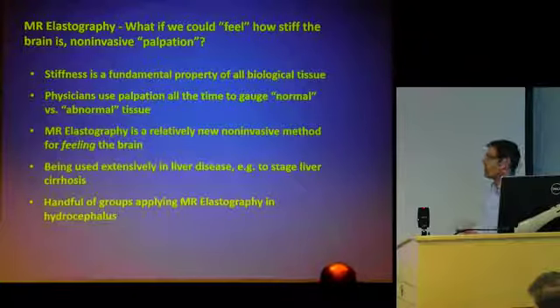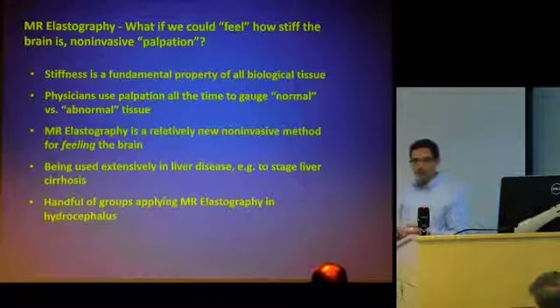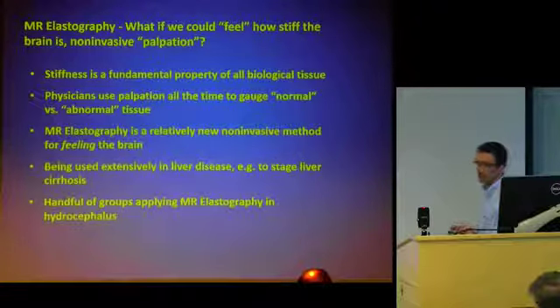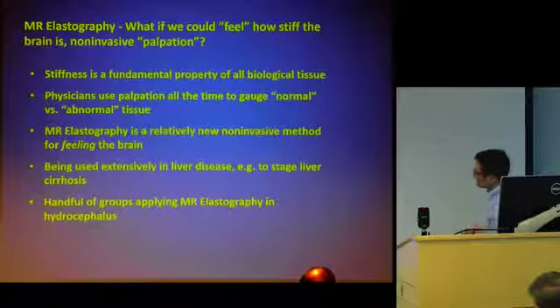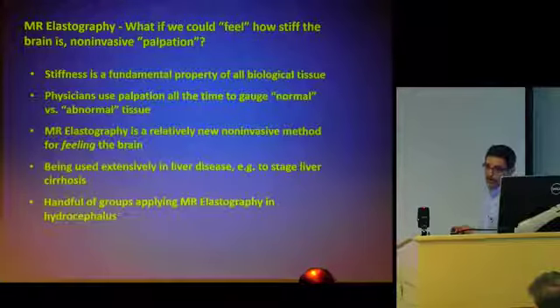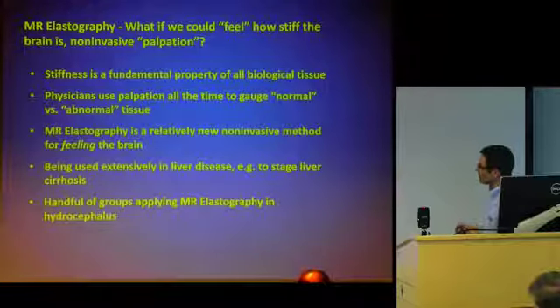So I think of elastography as essentially a virtual palpation technique. We'd like to measure the stiffness. Stiffness is a fundamental property that physicians use all the time. Elastography is a way of doing that non-invasively. Obviously, we can't palpate the brain.